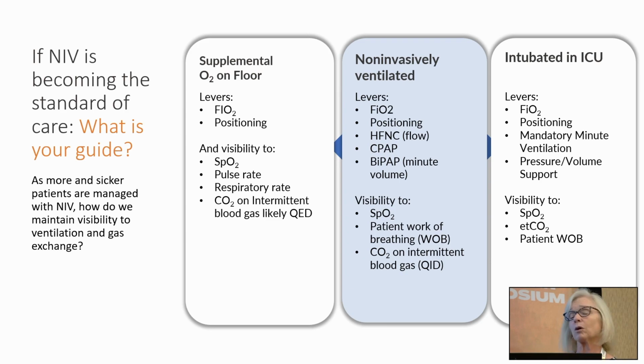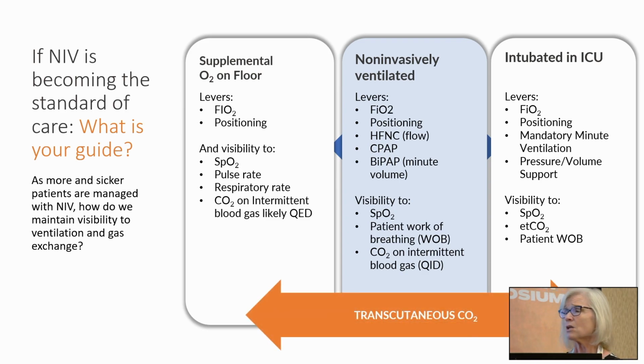So now we're using more and more non-invasive ventilation, which is great. It's great for the patient, it's great for the length of stay, it's great for the families, but you don't have visibility to their CO2 because end-tidal doesn't really work when they're non-invasive, and again, we're going to go into that more later. So if you can somehow continuously monitor their CO2 throughout this process, if you can use transcutaneous CO2 monitoring, it's going to really help guide you and help those patients when they are being non-invasively ventilated, whether it's just a high-flow cannula or if it's CPAP or BiPAP.